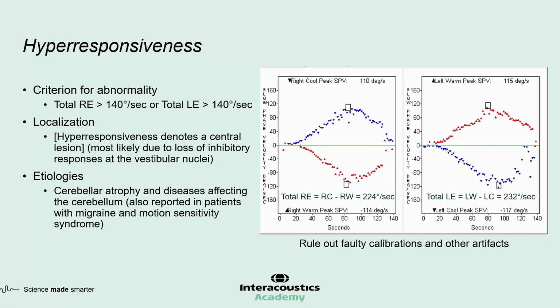around 220 or 230. And the fact that all these 4 irrigations have been completed is suspicious, because a patient who has 110 degrees of response would normally not be able to complete the test. So if the patient has all these 4 irrigations, and you see the patient really not under distress or feeling nauseous, then you have to ask yourself, is this real?